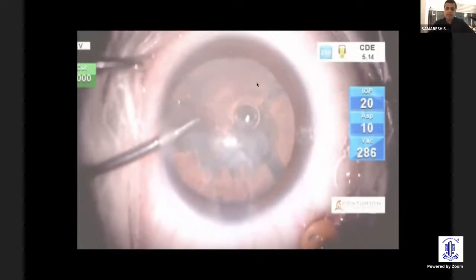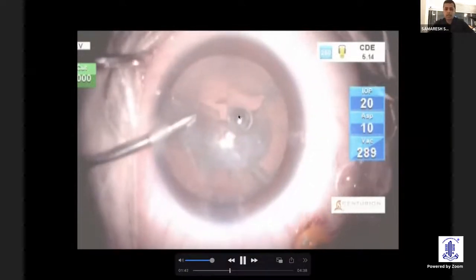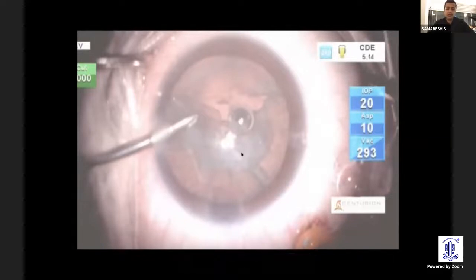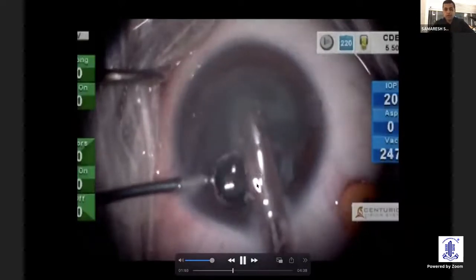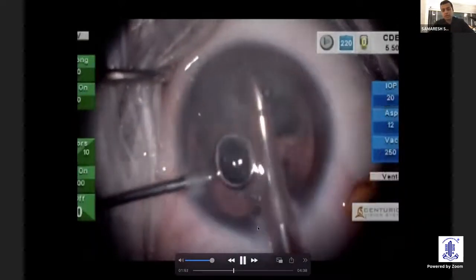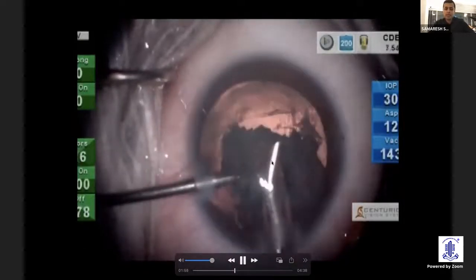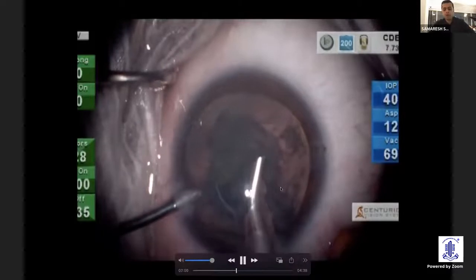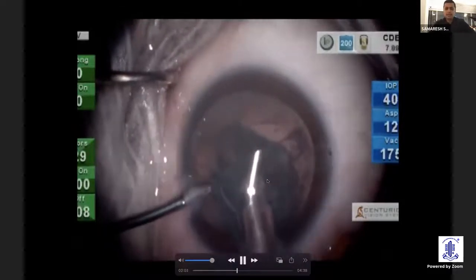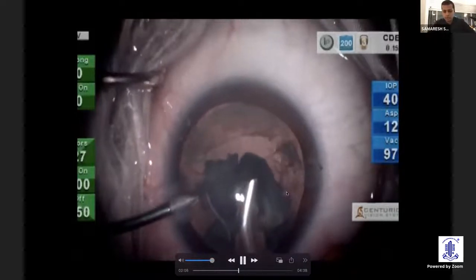The idea of vitrectomy for me is not to do a core vitrectomy, but just to clear up the area at the posterior capsule opening so that I have enough maneuverability in that area, because my incision is temporal and I have to remove this nuclear fragment. One of the choices I had was to make another incision and suture it, but I decided to go ahead in the same area. With the newer machines, particularly with torsional platforms and good followability, there is now a distinct advantage of having that nucleus always stay close to the probe.